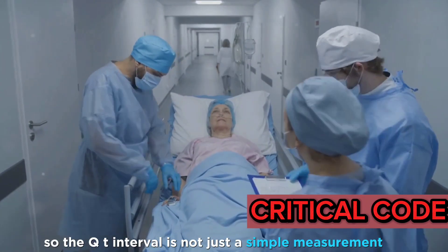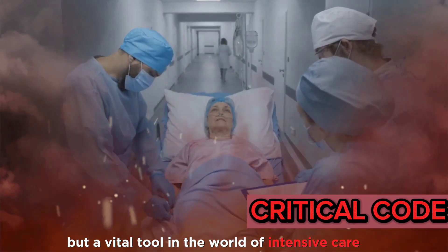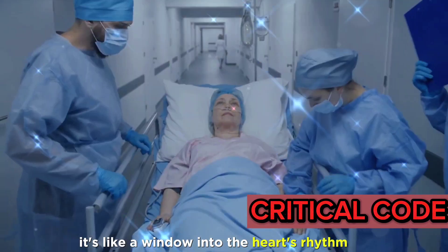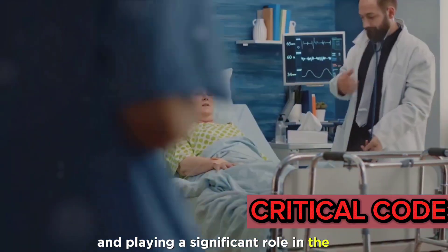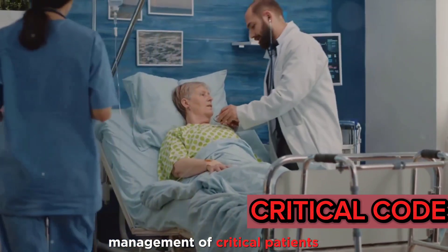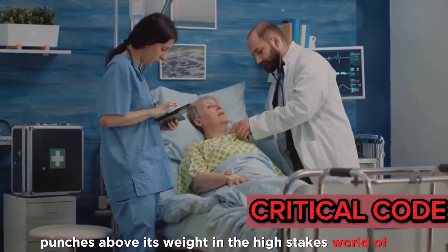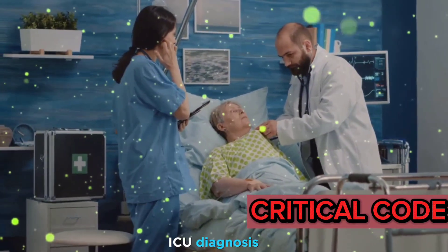The QT interval is not just a simple measurement, but a vital tool in the world of intensive care. It's like a window into the heart's rhythm, providing invaluable information to physicians and playing a significant role in the management of critical patients. It's safe to say that the humble QT interval punches above its weight in the high-stakes world of ICU diagnosis.